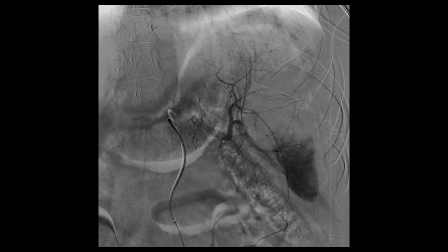So our normal splenic tissue should enhance, kind of like this part of the spleen, but this part of the spleen is not really enhancing. And then beyond that, we have lots of truncated arterial vessels. So this is all consistent with traumatic arterial injury. Now, can we go and put coils into each one of these positions? Yeah, probably, but it would be time consuming, and this patient needs to be stabilized quickly.